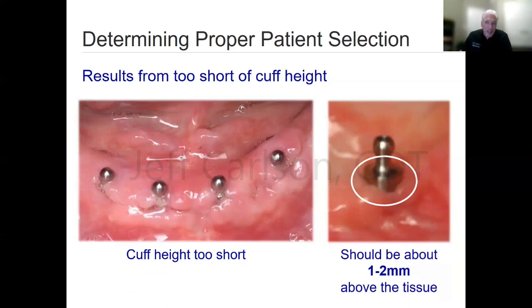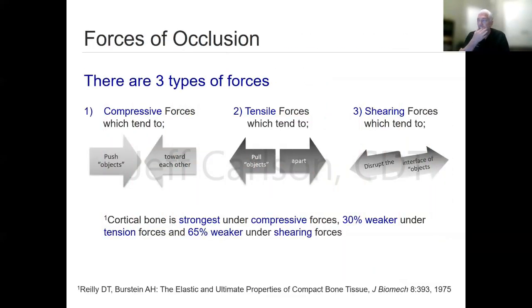I mean, a doctor gave me this photo years ago, but here's a prime example that can happen. So it's not uncommon. So we want to be careful when we're selecting these cases that we're making the right measurements and getting the right measurements.